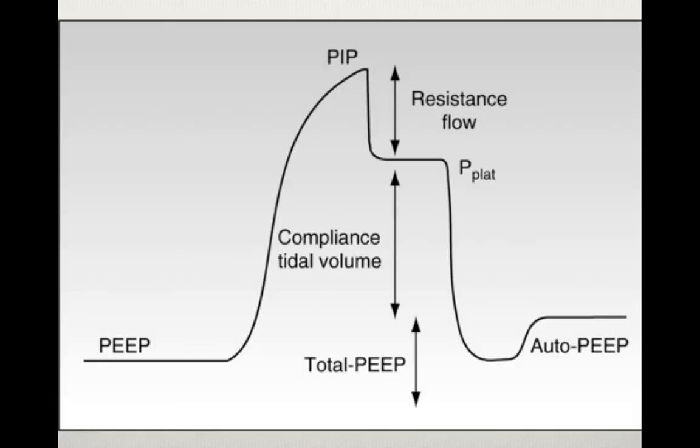the ventilator. So as we see here, we hit our peak inspiratory pressure, we have our P-plat there that we got with our inspiratory hold, we have the actual PEEP that's measured for our patients, and then we're going to go ahead and perform that expiratory hold maneuver to measure out the auto-PEEP. So total PEEP is auto-PEEP plus mechanical PEEP.